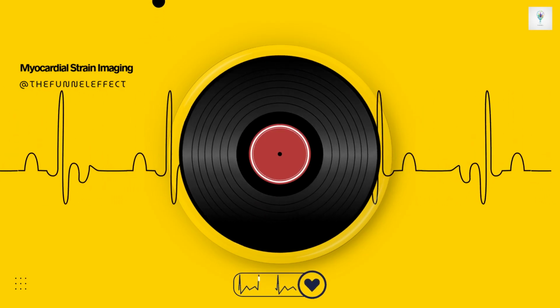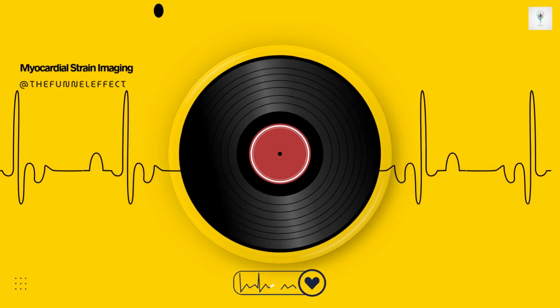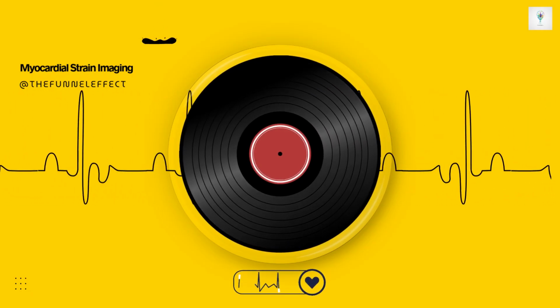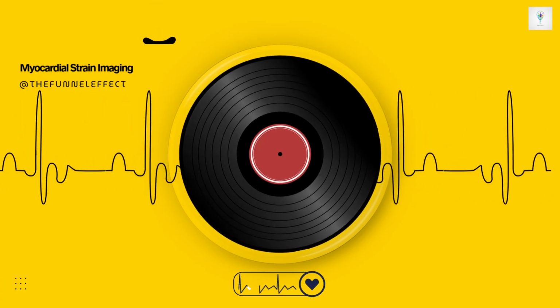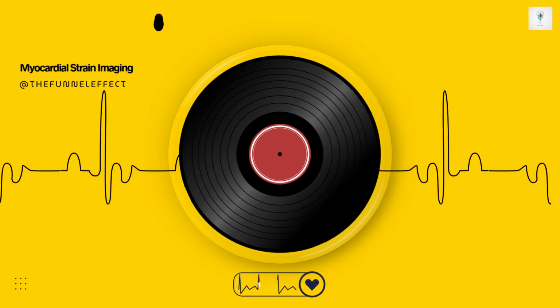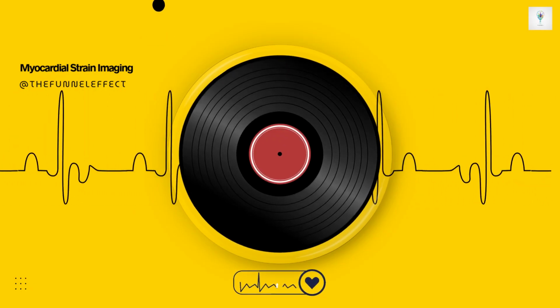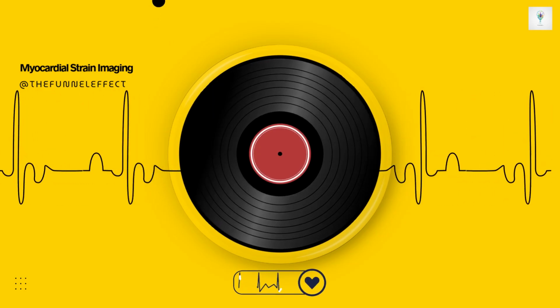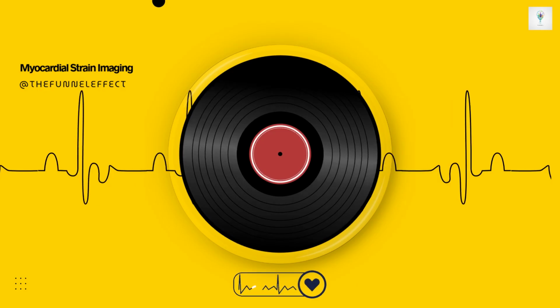And what's the clinical significance of measuring this? High mechanical dispersion has been shown to be directly associated with an increased risk for dangerous ventricular arrhythmias in several conditions, things like long QT syndrome, after a heart attack, and in various non-ischemic cardiomyopathies. It seems to offer important predictive information about arrhythmia risk, even beyond what LVEF tells us, by specifically flagging this temporal non-uniformity.